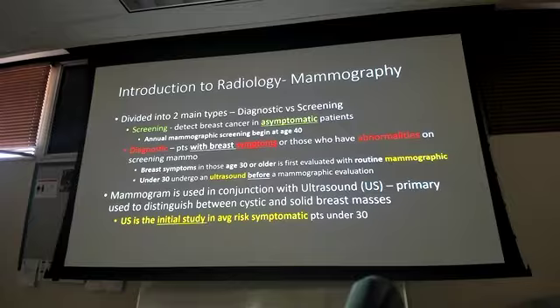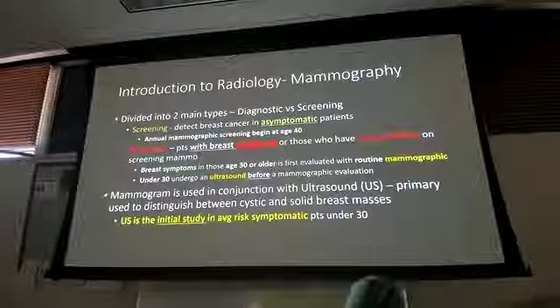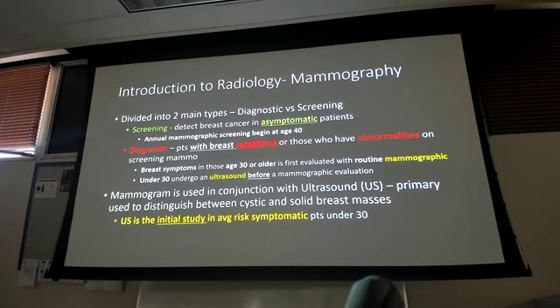It's not something structurally causing your pain. It could be X, Y, and Z. Now I can save you from the radiation. But if we see an abnormality on the ultrasound, guess what that patient's going to get? A mammo, to further clarify it. Because the other concern is if they're asymptomatic and I'm doing an ultrasound on the breast, there are chances that I might miss some of the breast tissue on the images that are taken, which means now I didn't fully evaluate the breast for breast cancer, whereas the mammo gets all of the breast tissue.